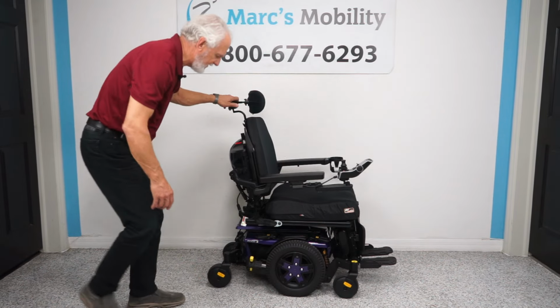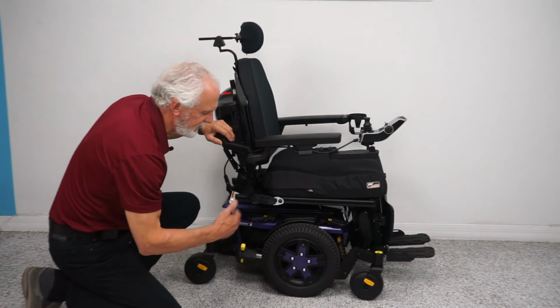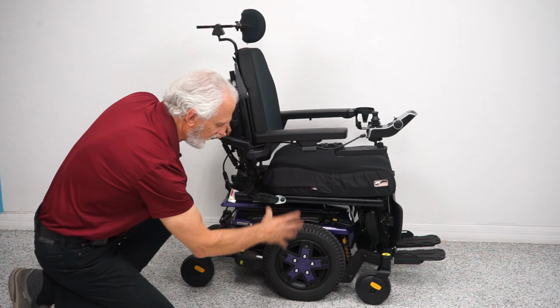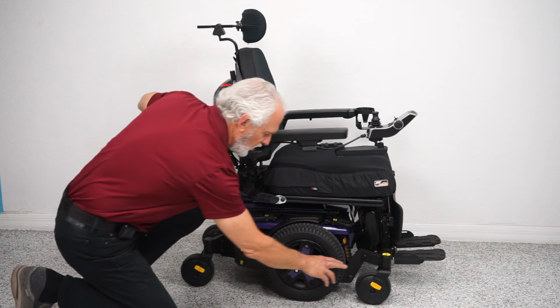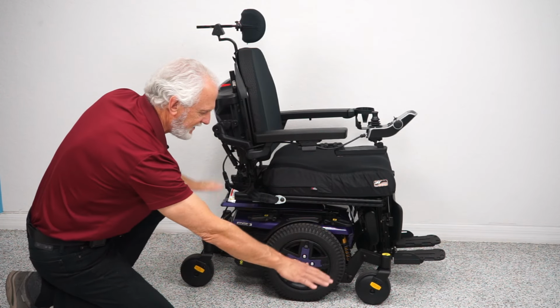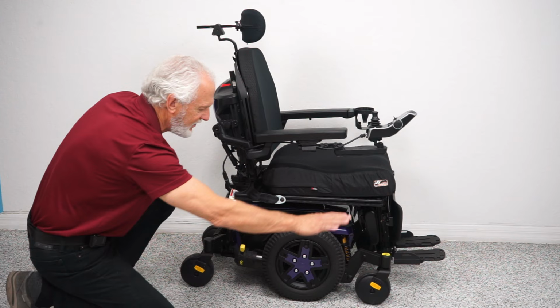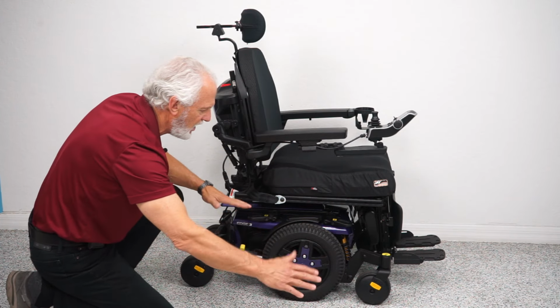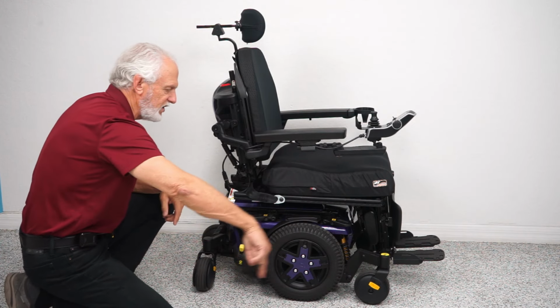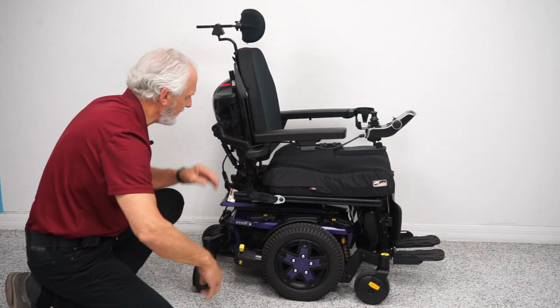Also, I want to show you the base on this chair, okay? So this is a mid-wheel drive, so that means your drive wheel is going to be in the middle of the chair roughly, okay? When you have a mid-wheel drive, you're always going to have a wheel on the ground in front and a wheel on the ground in the back, because that keeps it from pivoting, okay? And that's how you get this really good turn. And when you turn a circle, the wheels will pivot this way to keep the chair in the same spot all day long.